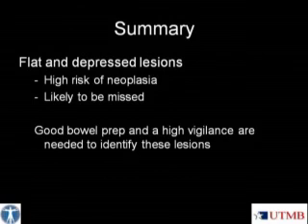In summary, flat and depressed lesions have a high risk of neoplasia and are likely to be missed. Good bowel prep and high vigilance are needed to identify these lesions.